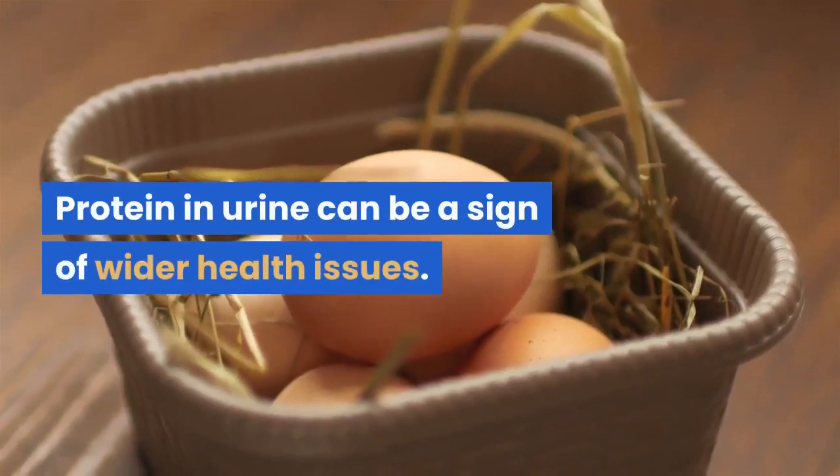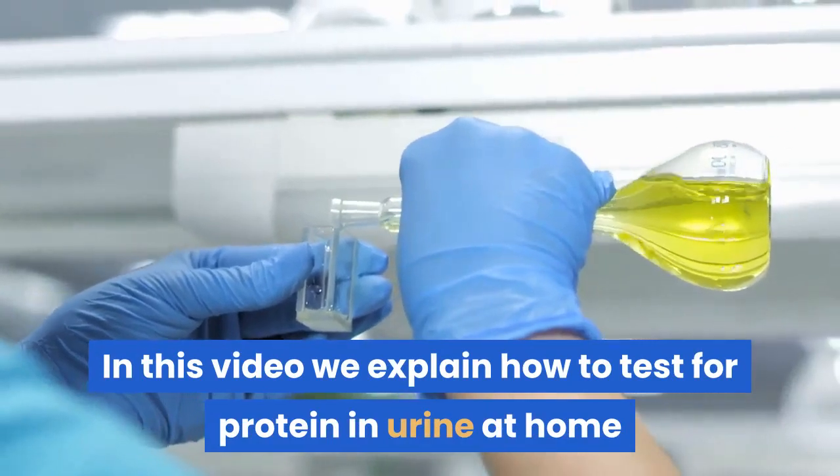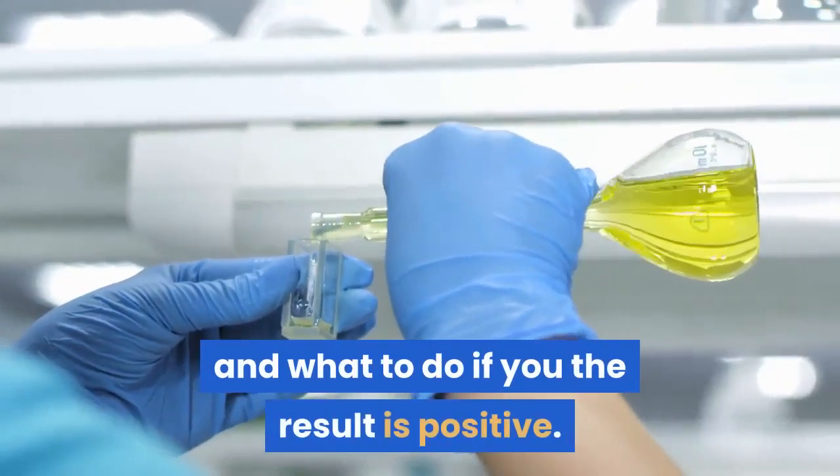Protein in urine can be a sign of wider health issues. In this video we explain how to test for protein in urine at home and what to do if the result is positive.